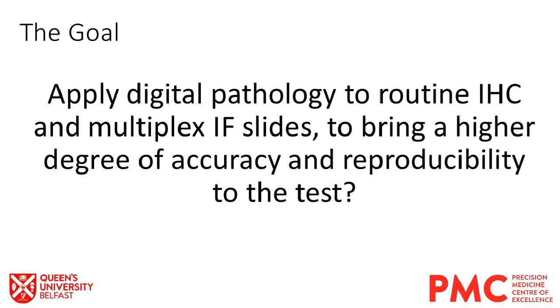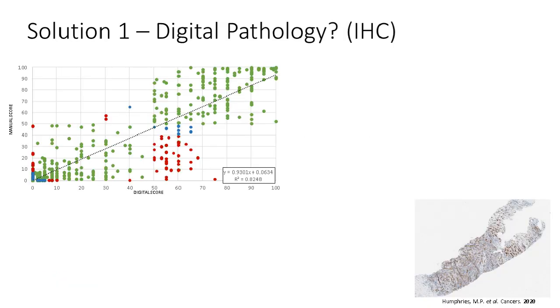So the goal was to apply digital pathology to our routine IHC and the multiplex slides to try and bring reproducibility and accuracy to the test. And there were several solutions that we employed to try and achieve this.